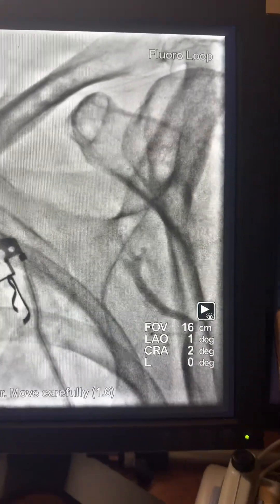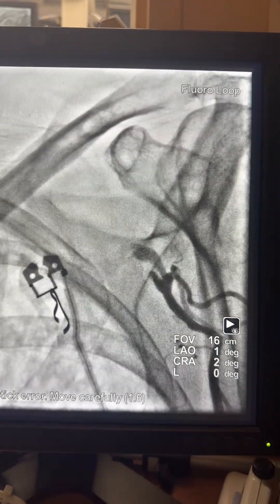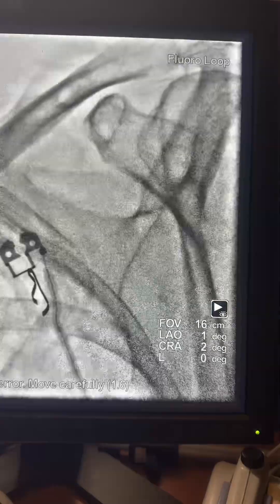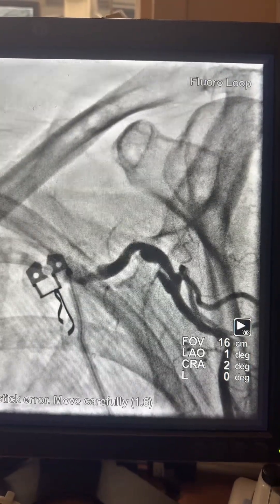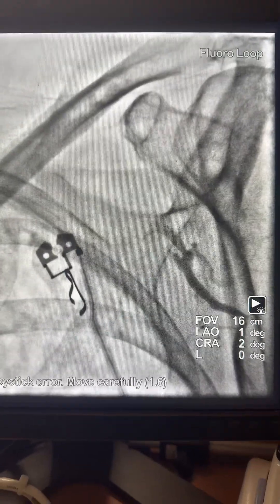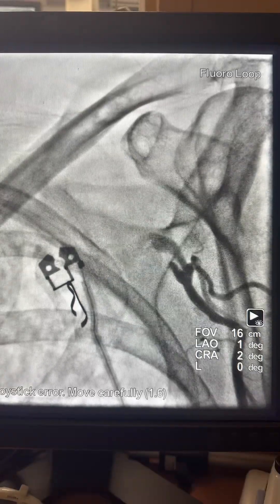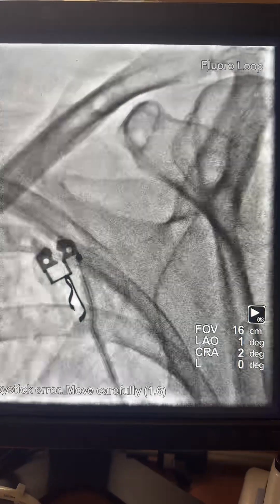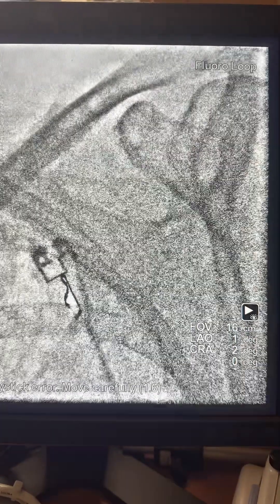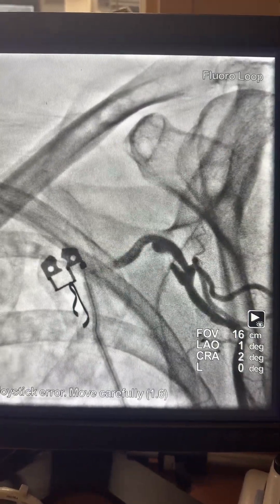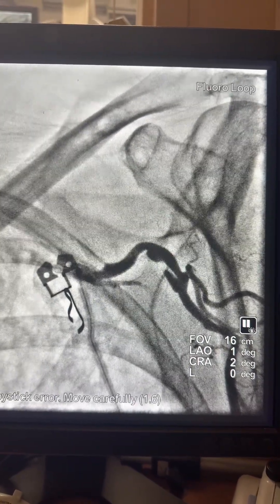Hello friends, this is a peripheral case I would like to share with you. A 67-year-old with extensive peripheral artery disease who underwent fem-pop bypass for the left side recently and was referred to me for heart cath for MI post surgery. He never had a heart cath before and had no access whatsoever — all other access sites are occluded, and the only access I found is the left brachial. The patient was already on pressors.